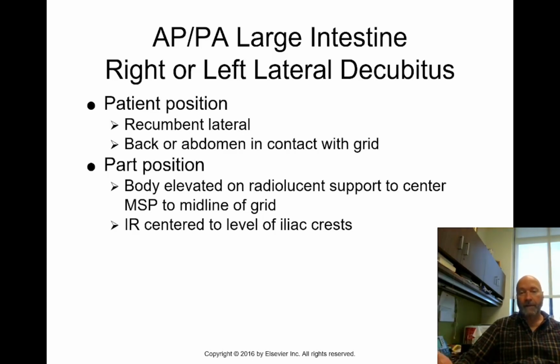Your rectum is going to be the last image before the patient goes and evacuates their bowel. But before you get to that point, you've also got to rotate the patient another full revolution, and that is so that we can do a left or right lateral decubitus position. So what we're going to do is rotate the patient all the way up onto their side.